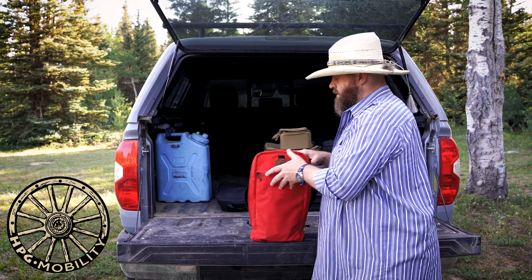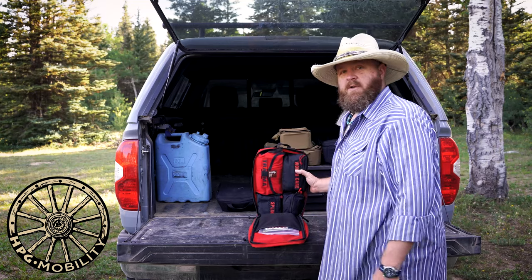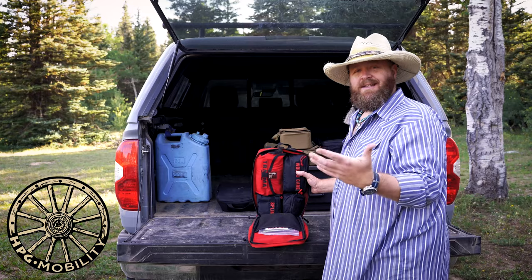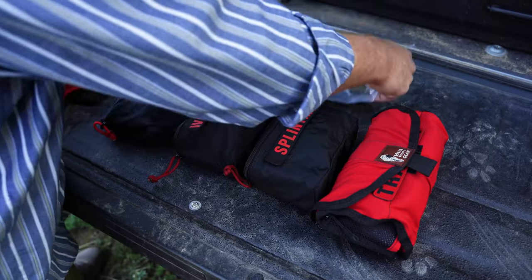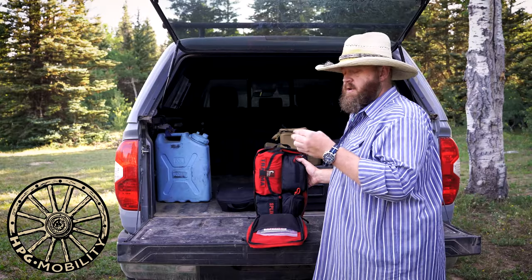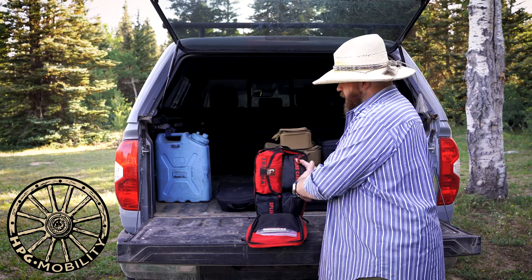When you get the Expedition Kit it won't look quite the way this looks, because for FDA reasons it can't be packed into these sub bags. So what you'll get is an overall large plastic bag that has the components themselves with a packing list inside plastic bags, and then it'll be up to you to do the organization the way you want. All of these different bag modules have velcro strips, so you can choose what your trauma is, what your wound care is, and what your priority is.